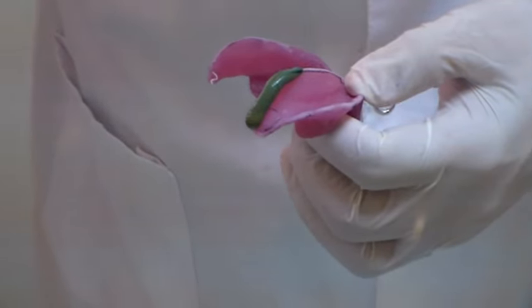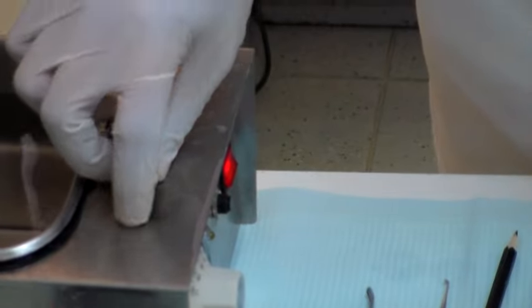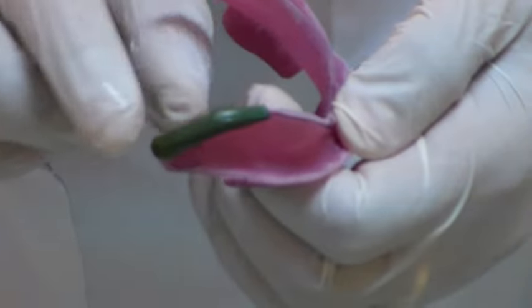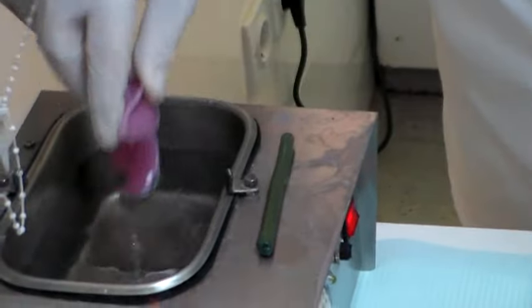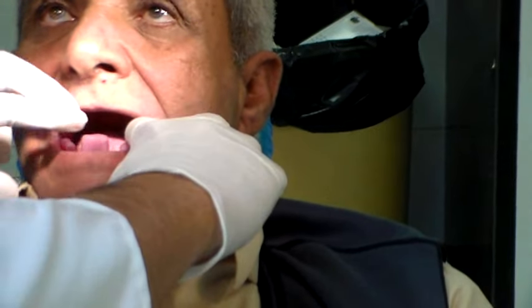I've just done my lateral throat form area. I'm going to soften it a bit, dip it in water, and roll it to get it ready for next time. If it's going off the tray, you can put it back onto the tray, but you should have a wet finger — wet your finger and pull it onto the tray. Then soften it again until it's nice and shiny. Come into the patient's mouth, rotate it in, lift up the tongue, and place the tray in position.